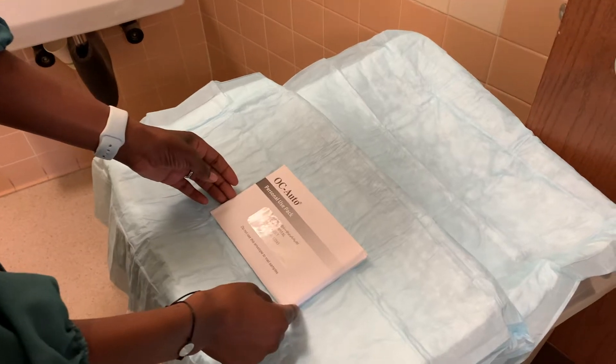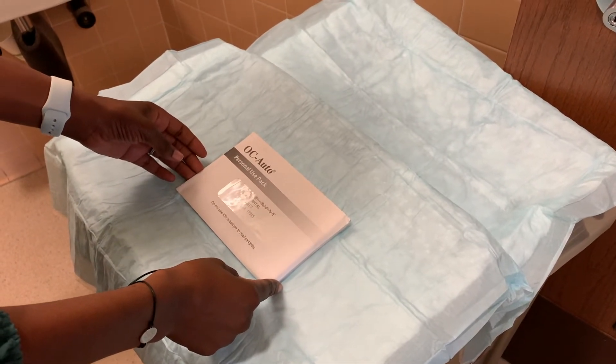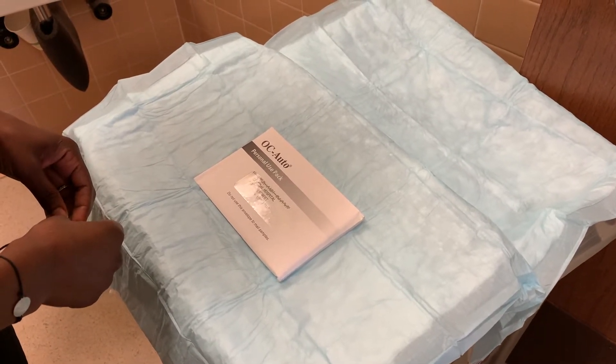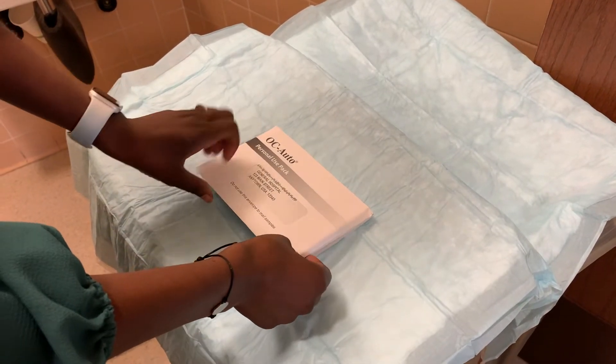This is the FIT kit, and you may receive it in clinic or at home by mail. This test is for colon cancer screening.